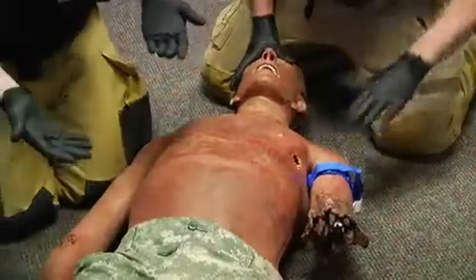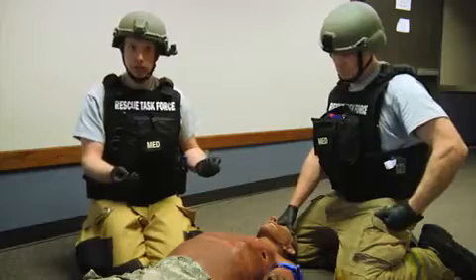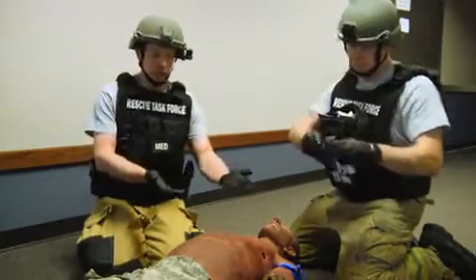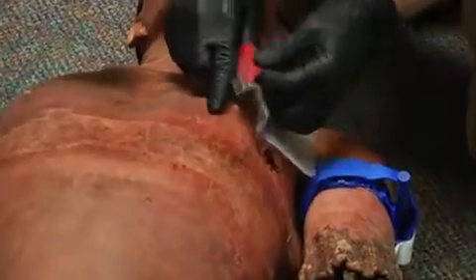As you can see here, our patient had a couple of amputated limbs that we've treated with tourniquets. We're now going to address the airway. The first thing we want to do as we look at this chest, we can see a wound here that needs to be dealt with. Mark is going to cover that with a vented chest seal. He wipes away the blood at the opening to the wound and places a vented chest seal across the wound. You can see that there are vents that will allow air to drain out should it need to.